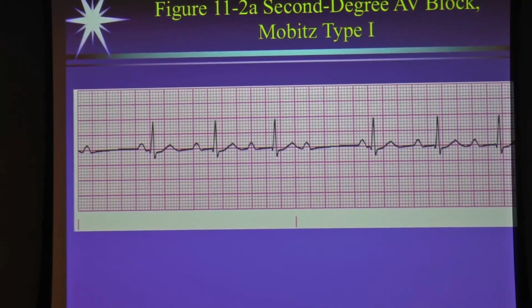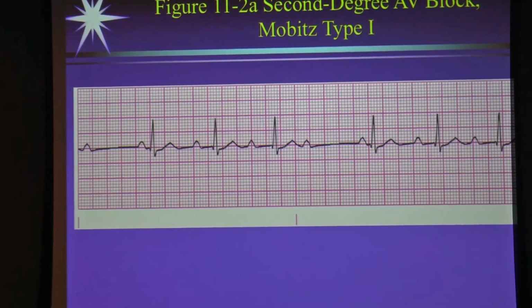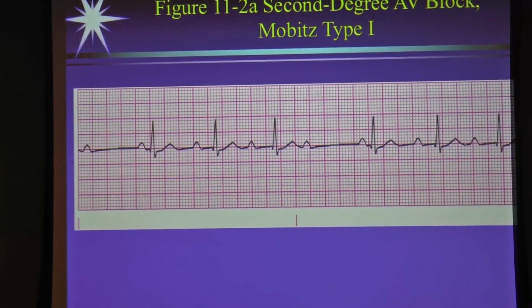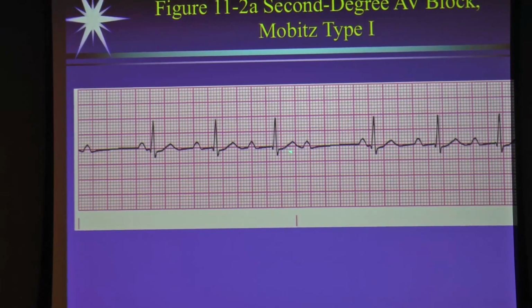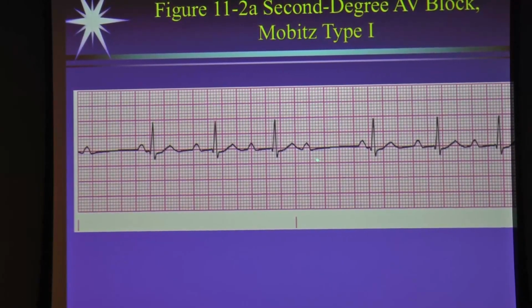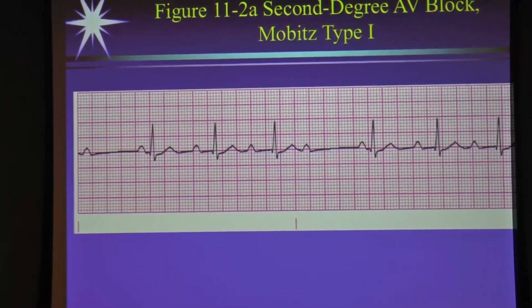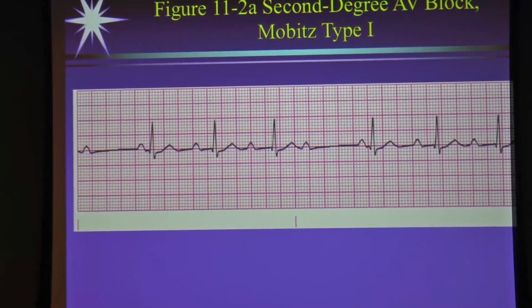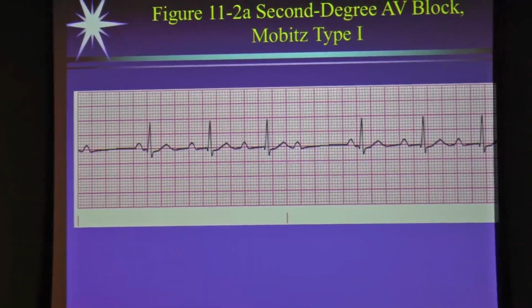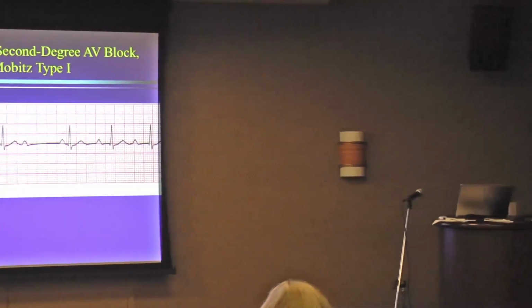When this occurs over 3 or 4 beats, it's very easy to pick out. The problem is when it happens quicker. It doesn't have to be that way. It could happen in 2 beats, and it becomes a little harder because people may say, oh, it's a premature beat, or it's not a beat, and get all confused. This really comes down to whether the patient has any symptoms or not, or how slow the heart rate is. And again, you're not treating the heart rhythm, you're treating how the patient's tolerating the heart rhythm. So if it's too slow, you're really treating a bradycardia. You're not necessarily giving a specific treatment for a second-degree heart block type 1.